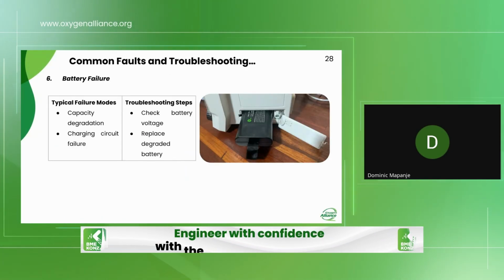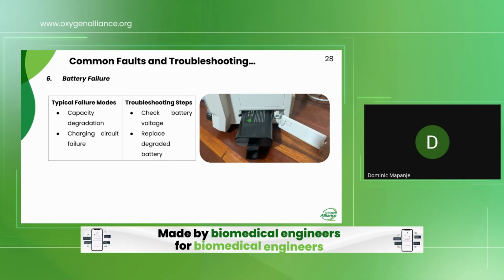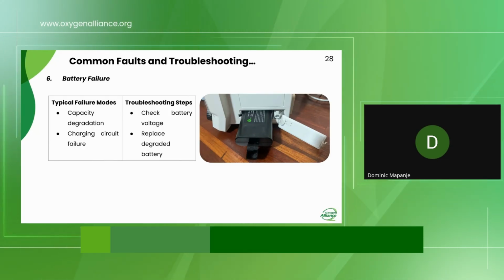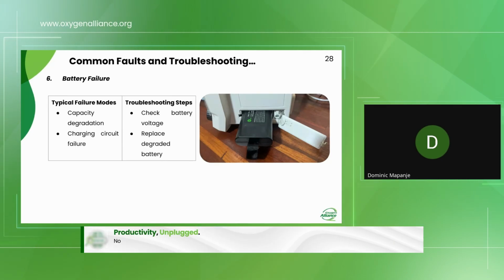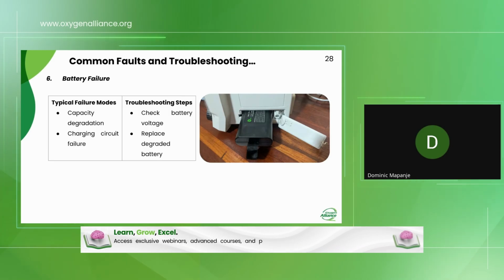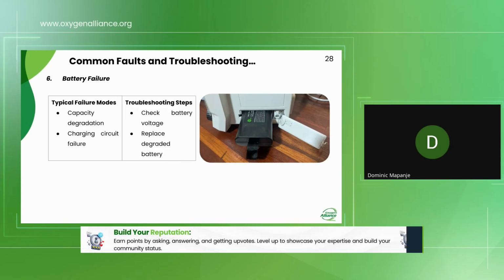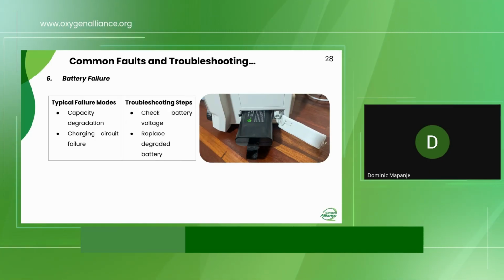And then there's battery failure. Of course, you may find that the batteries have been removed from the monitor, which I think you can call human error. But you can also find that the battery has degraded and there's capacity degradation, so it's no longer able to store or give out energy. There can also be a charging circuit failure, so the circuit is no longer able to supply power to the battery.